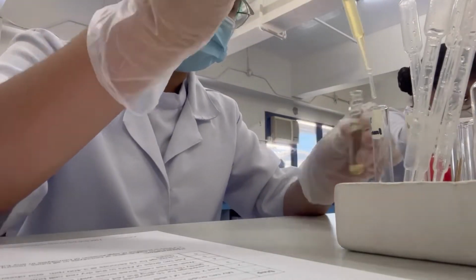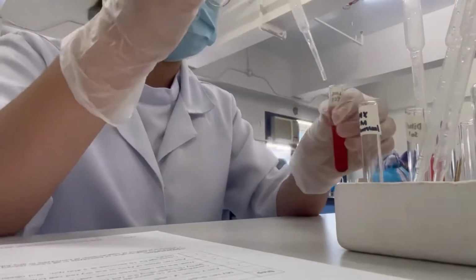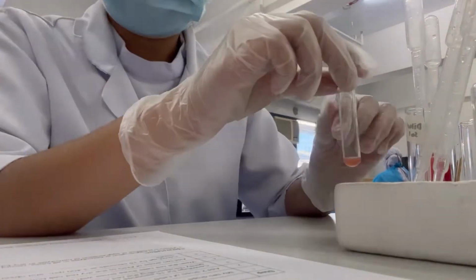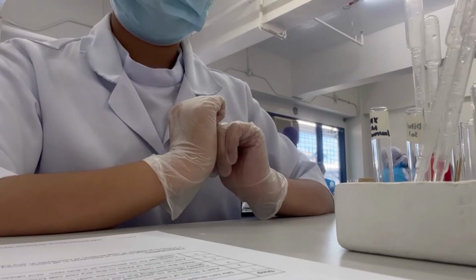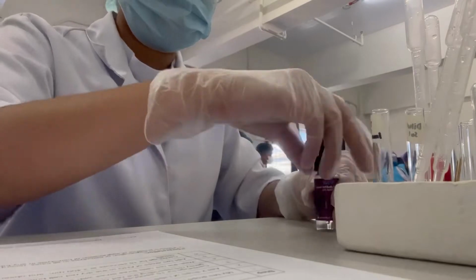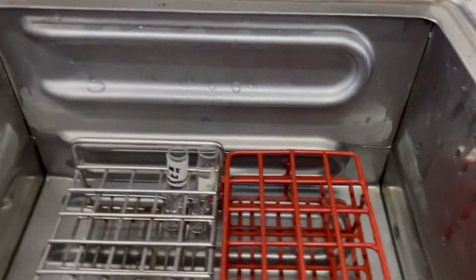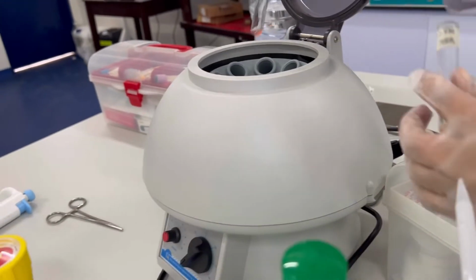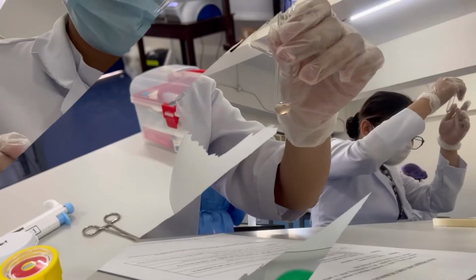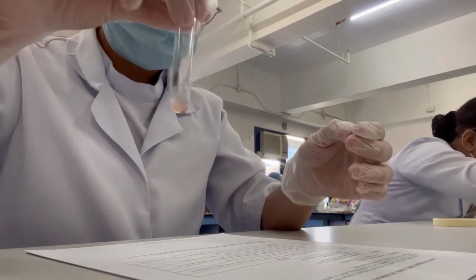Mix 2 drops of patient's plasma or serum with 1 drop of 2 to 5% donor's red cell suspension. Then add 2 drops of LISS and mix it. Then incubate at 37 degrees Celsius for 10 to 15 minutes. Centrifuge for 15 seconds at 3,400 rpm. Observe for hemolysis and agglutination by gently resuspending the red cell bottom.